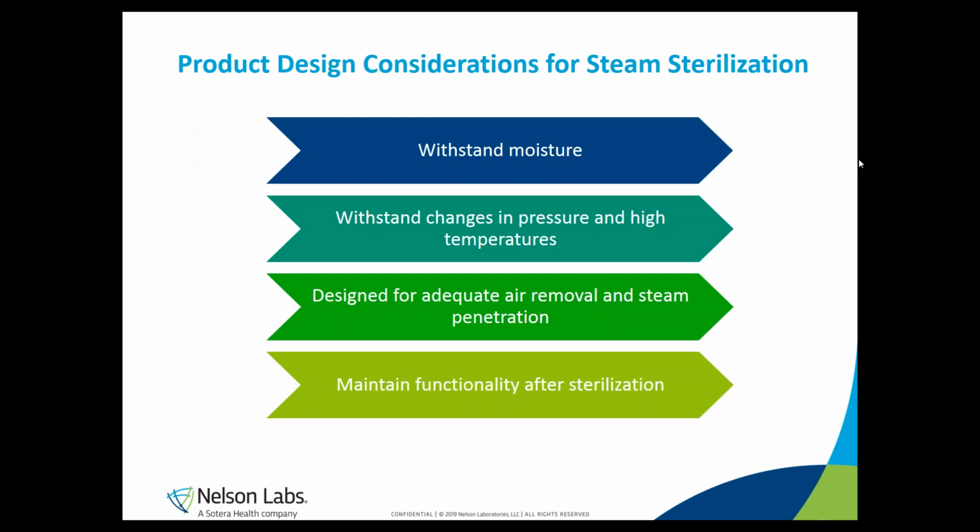During the design of a reusable medical device intended to be repeatedly sterilized and reused, manufacturers should direct their attention to compatibility of materials with the sterilization process, but also product configuration and product functionality. Selected materials should be compatible with the specific conditions or potential effects of the process.